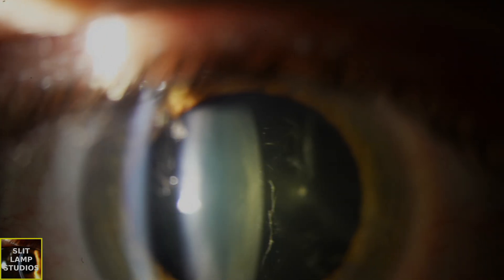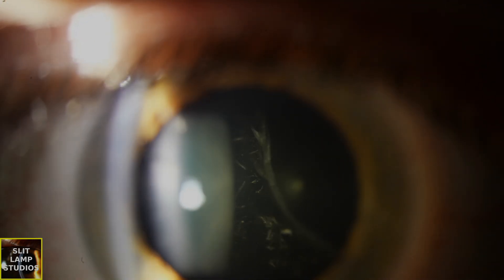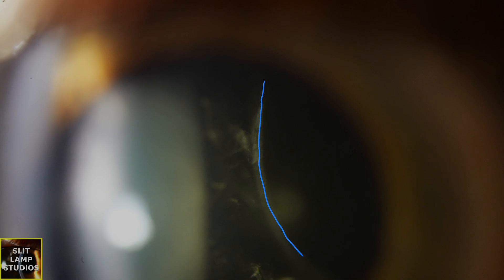We can see that the patient's phagic, and the patient's got a PVD. What I'm drawing on here is the posterior hyaloid membrane, and you can see there's this optically empty space behind it. The patient has a PVD.